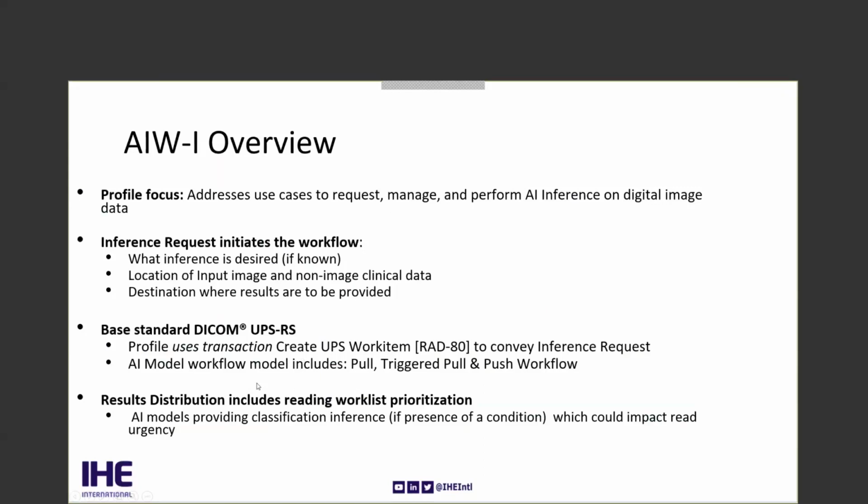We've also included, because what we're finding in the AI models today is that they may actually find some results which would need attention in the workflow. So in this process, we've included the ability to notify the reading workflow manager that there may be a condition that needs to be addressed.